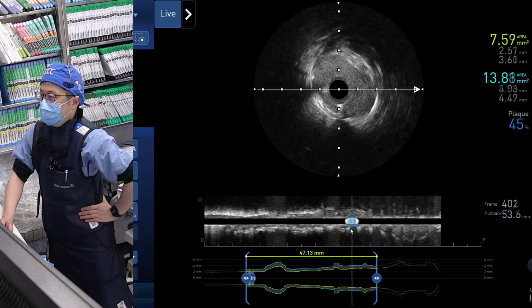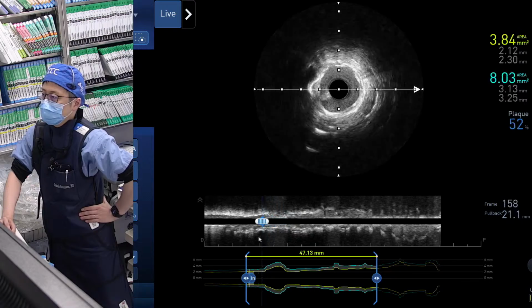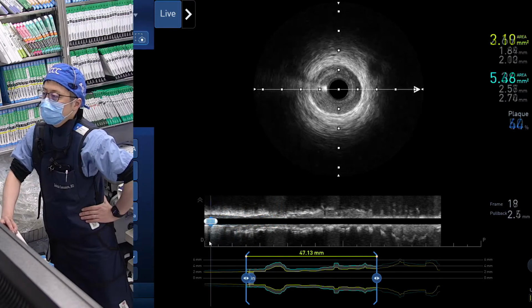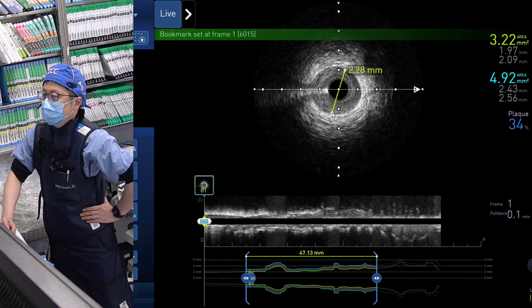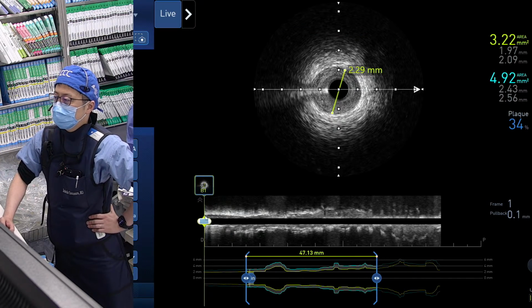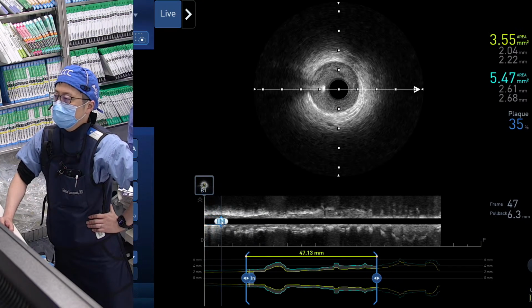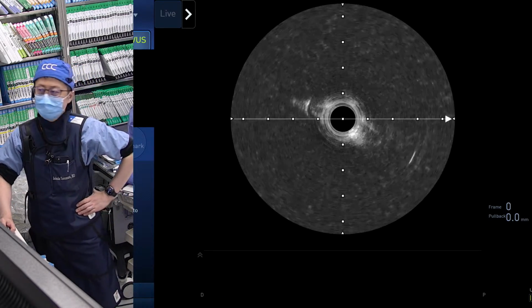The question comes here: America versus outside? Outside, everybody will put a drug-coated balloon. Should we do a drug-coated balloon now? Okay, that's the key. No, I'm doing side branch IVUS because Kiski always likes side branch IVUS. Sure. I went to 20 atmospheres at the ostium with a high-pressure balloon. I want to make sure the ostium looks good.